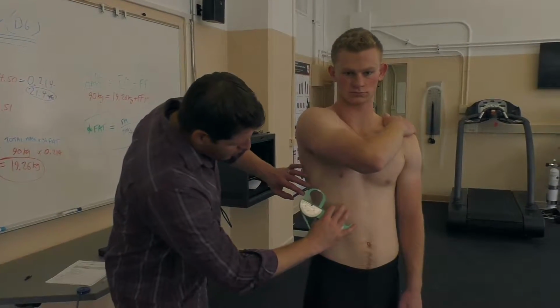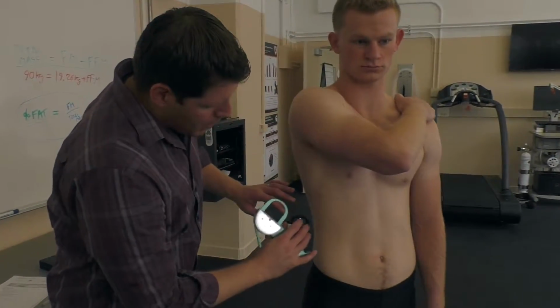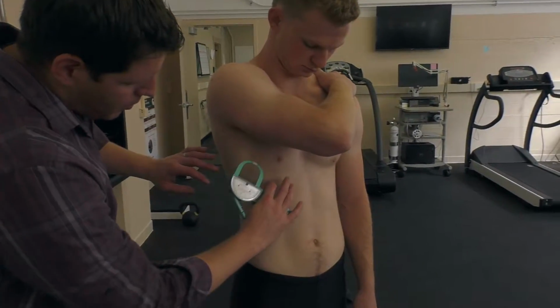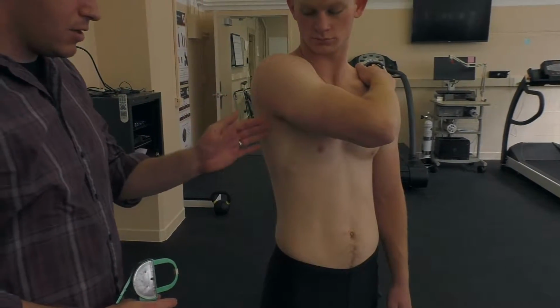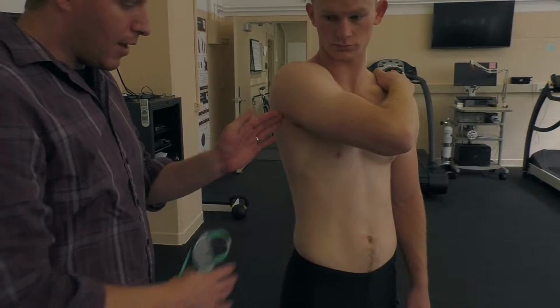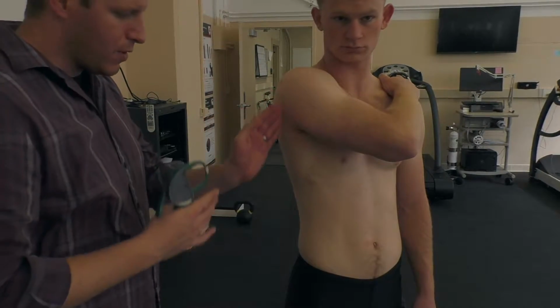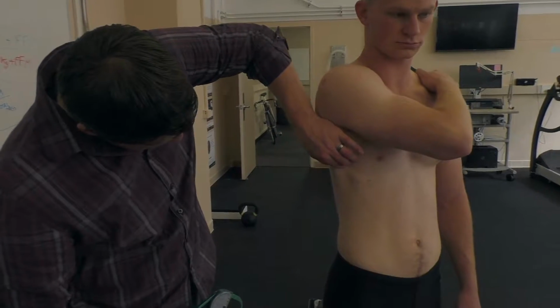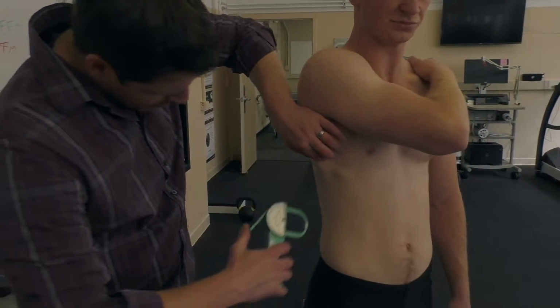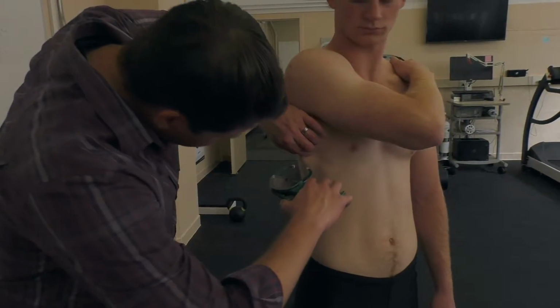And it's at the level here of the chest. So what we do is we draw that over, and then it's at the mid-axillary line, not the anterior axillary line or the posterior, but sort of at the mid-axillary line here. And it's another vertical fold. So reach down and get muscle, and then let that muscle slip out, and what's remaining is your skin fold.